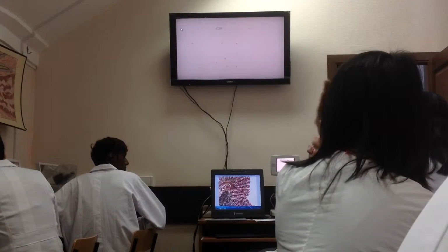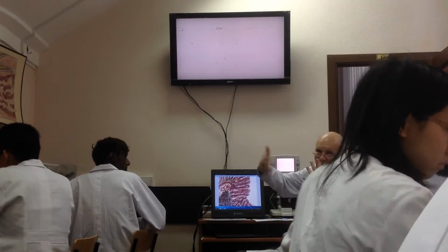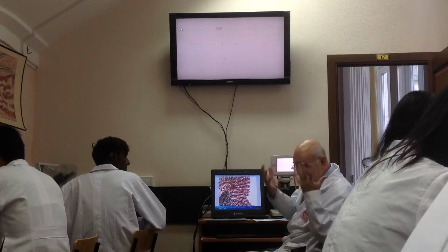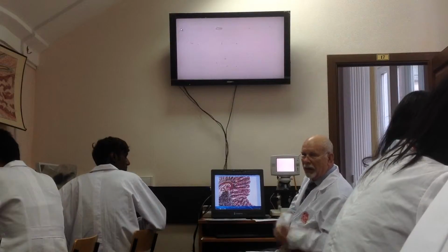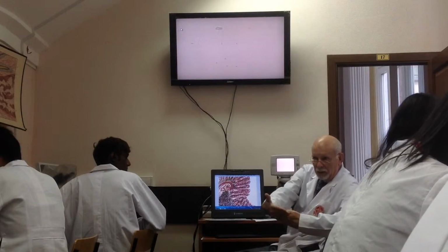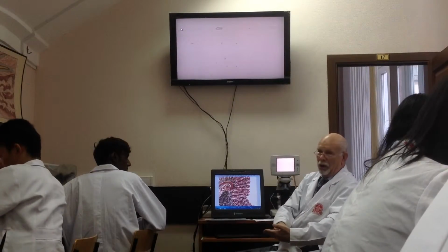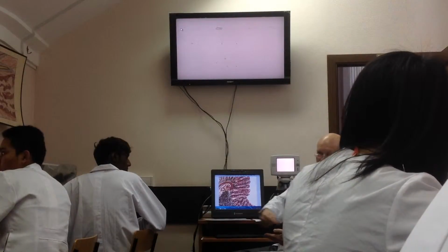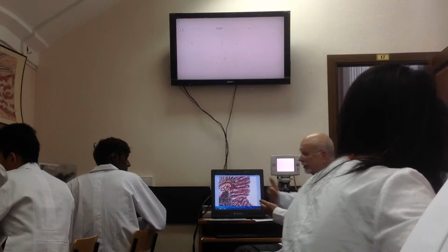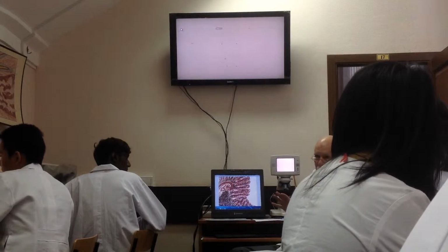Instead of pancreas, say parotid, because both are basophilic in color, colored in blue or violet. It's somewhat confusing. But to differentiate, we must put the slides on the stage and compare. It's parotid, it's pancreas. What's the difference? Here islets present, here endocrine islets absent. Tinctorial property of cells and so on. So different morphological features.